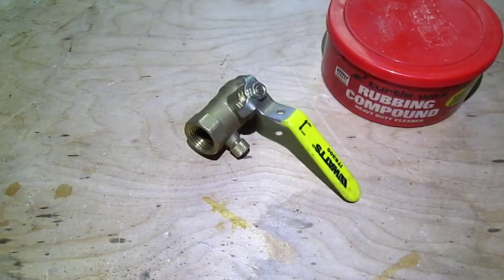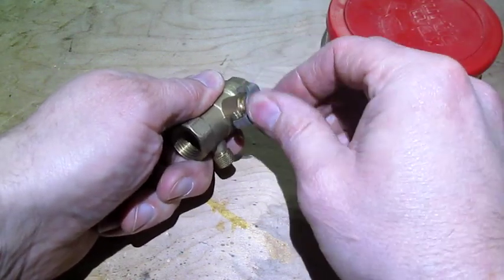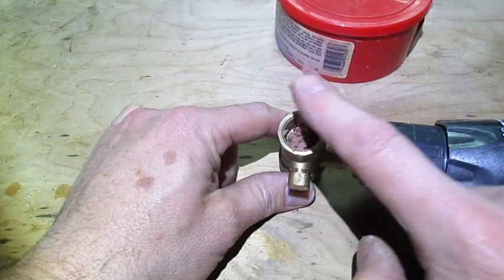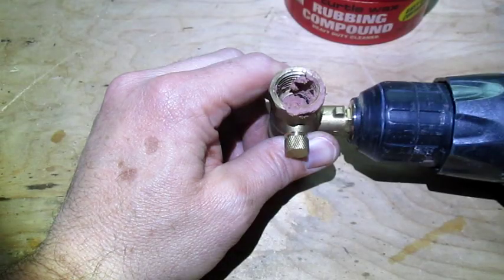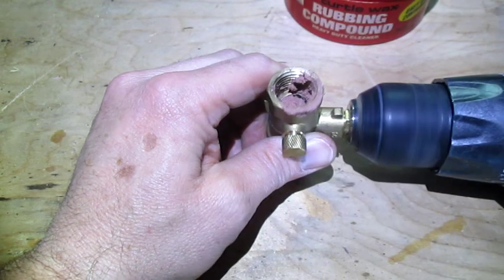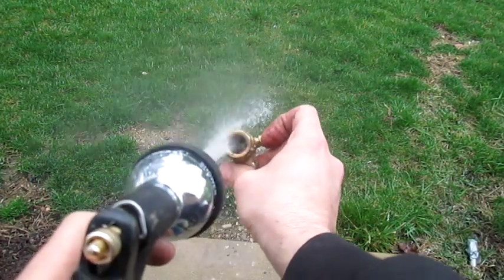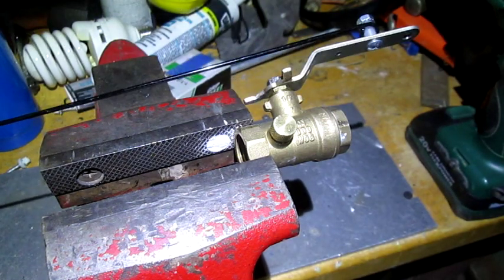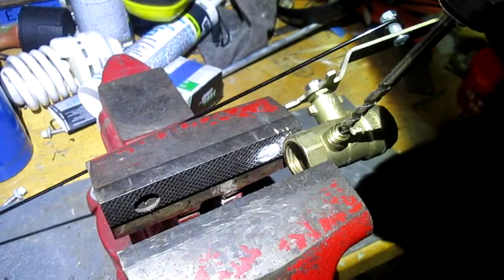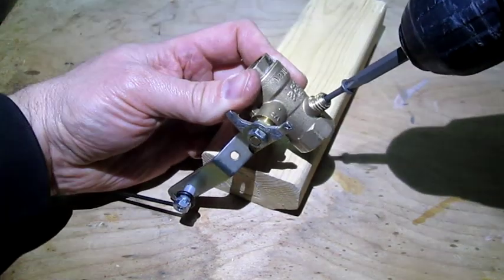Now we need to control the exhale. This is a half inch ball valve and we want to make it looser. So I'll take the handle off, put some rubbing compound down in there, which has grit in it, and spin the drill to loosen up the valve. Then wash it out really well with water. I've added a screw and another piece of coat hanger wire so we can open and close the valve.